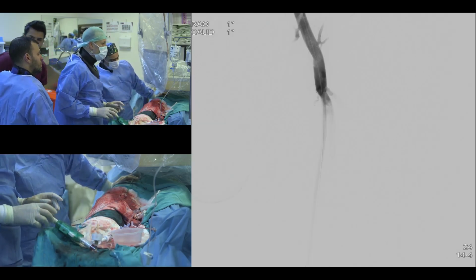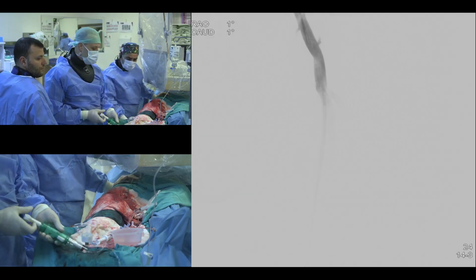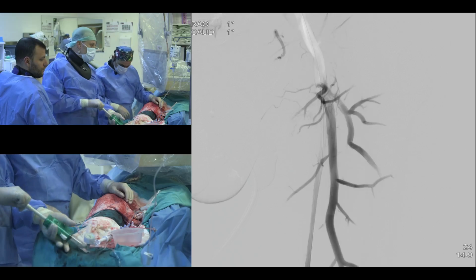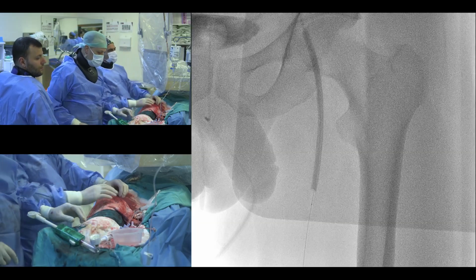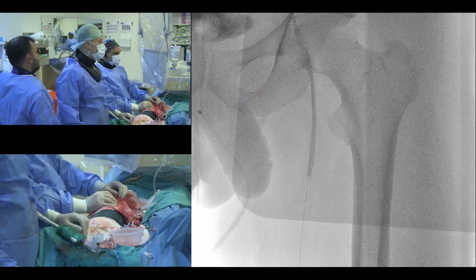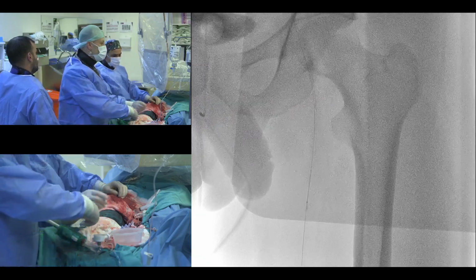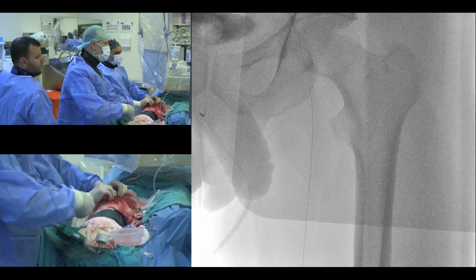And so the first time I didn't put a stent, but he still shut down. Second time I put a coronary stent, he shuts that down. Third time I do shockwave, he shuts down. So the fourth time now, hopefully with no band. So a lesson learned for me, and I'm just sharing it with you because I'm still learning in my life.